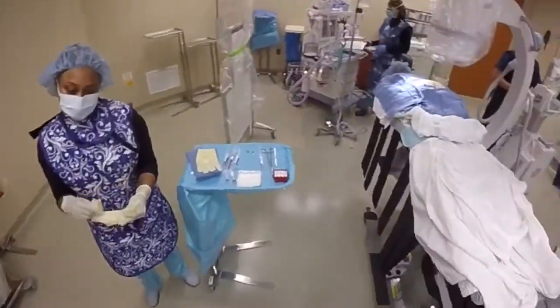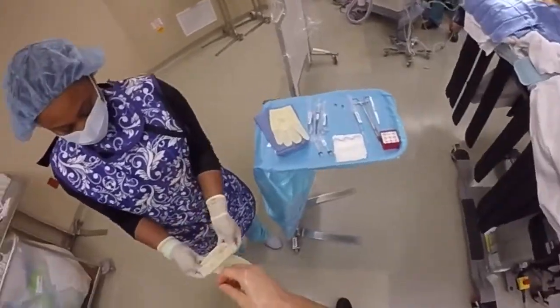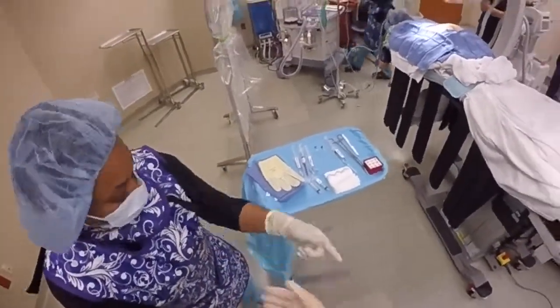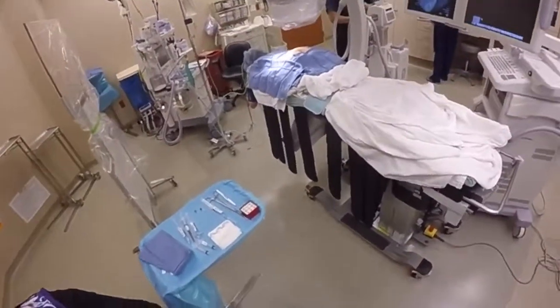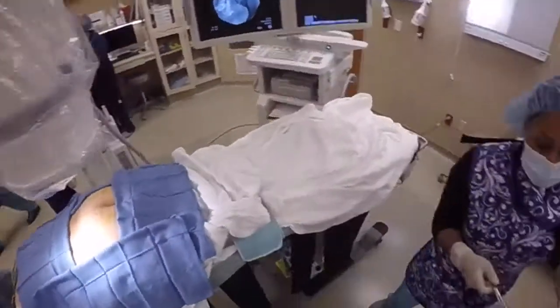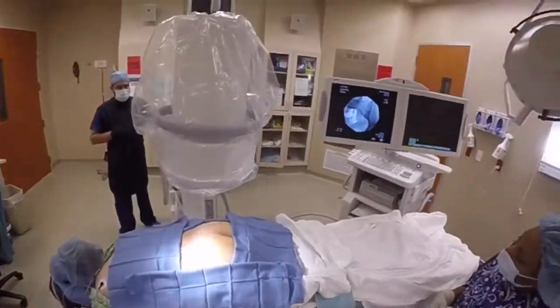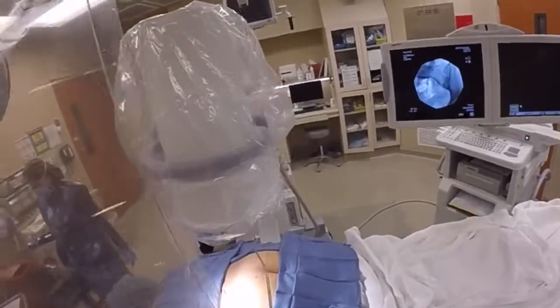Today we're going to demonstrate how to do a piriformis injection under fluoroscopy. The piriformis muscle is one of the muscles of the gluteal area that very commonly causes an entrapment syndrome called piriformis syndrome, leading to pain down the lower extremity resembling, most of the time, sciatic pain.